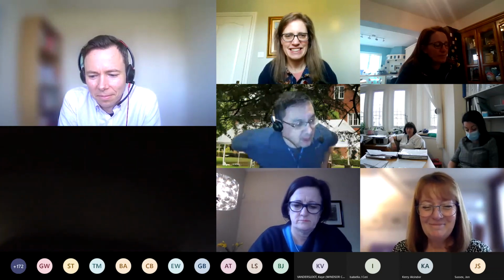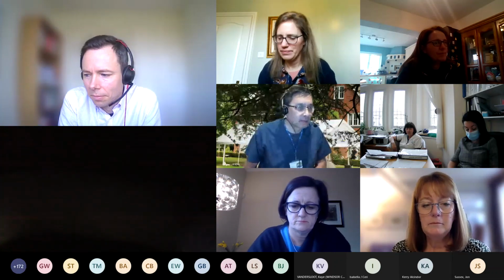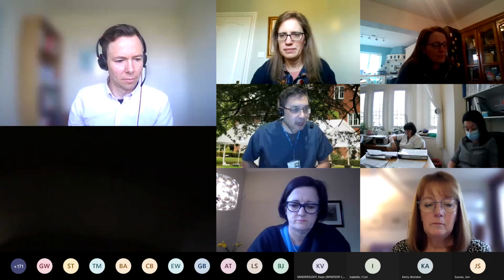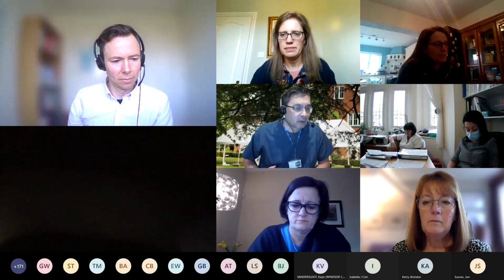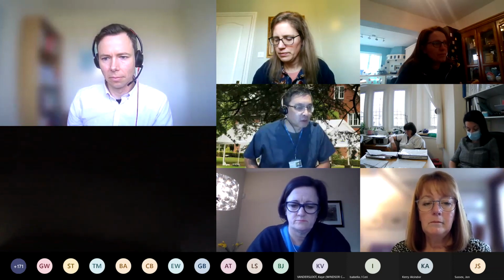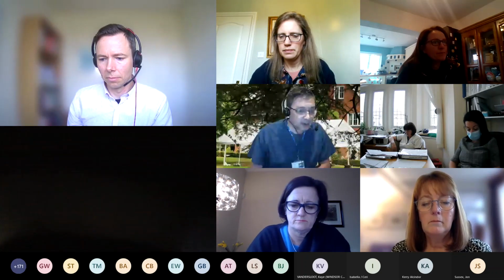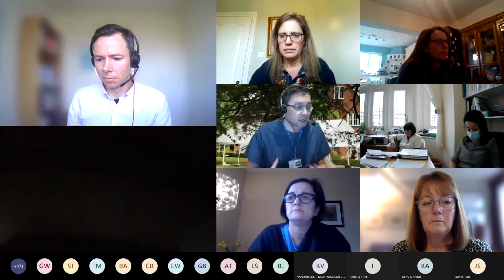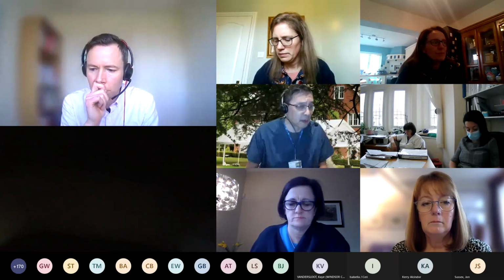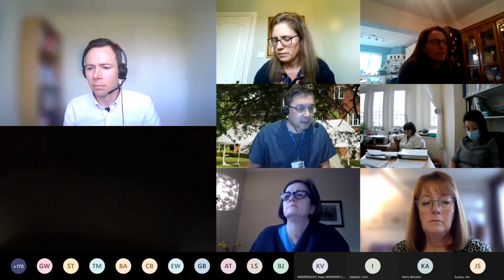Well, I was just going to say, I think this is going to apply to any kind of care home, whether it's a learning disability or an older age care home. I think the principles are just the same. We have to be thinking about capacity decisions as well, and how to explain what you're doing and how you're using the particular device. Sometimes that's going to be nuanced differently for a resident with learning disabilities as opposed to a resident, say, with dementia. So I think the application of the pulse oximeter is still important.